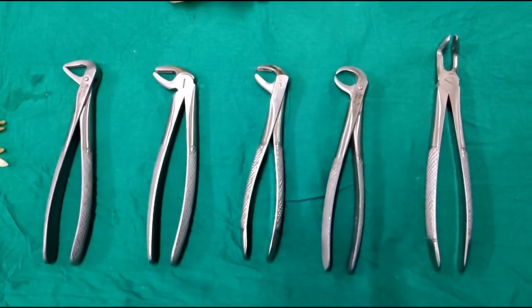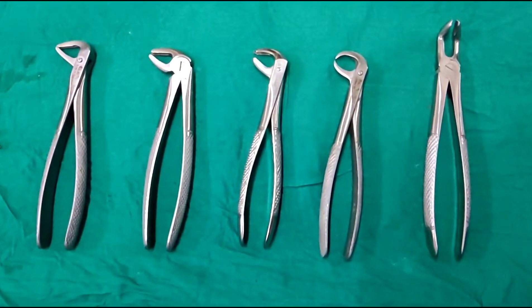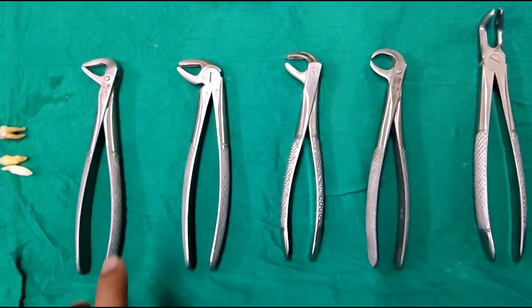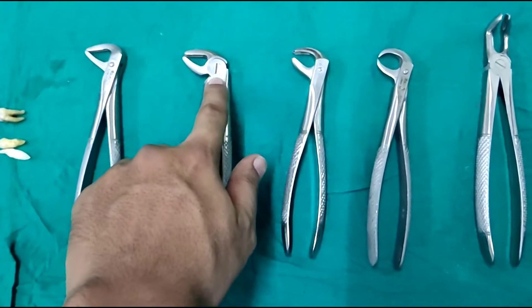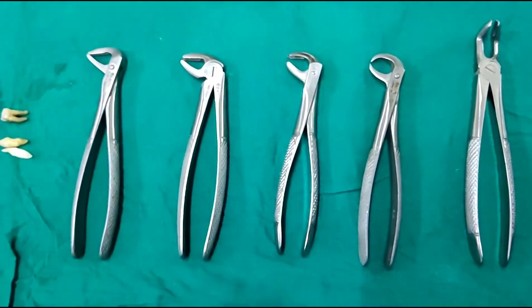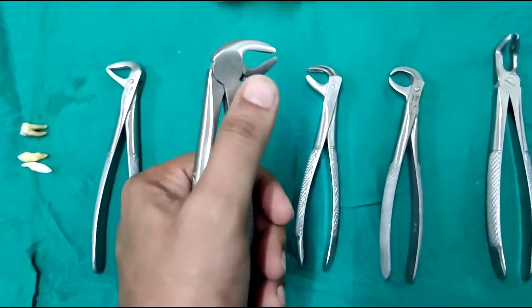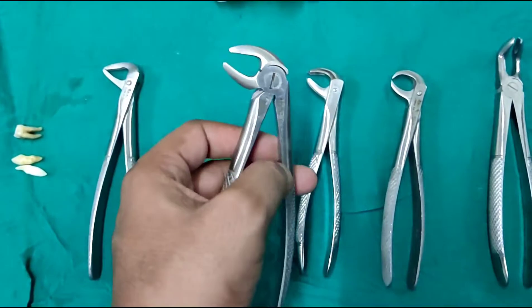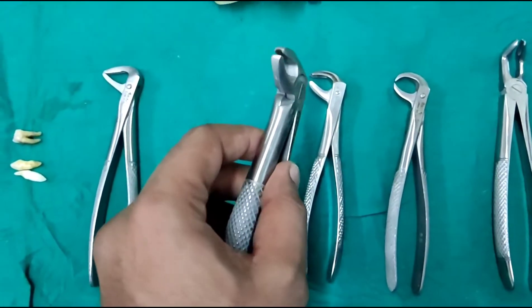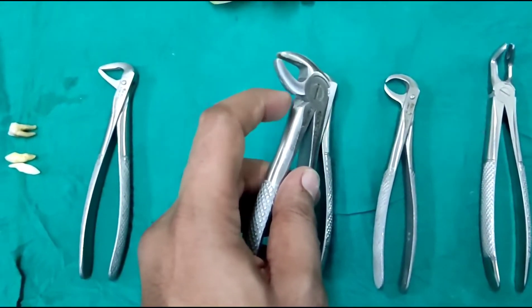Let us look at the dental forceps of the mandibular region, or the lower jaw. Each forceps, be it maxillary or mandibular, comes with three parts: the handle, the hinge, and the beak. The beak is the working part. The handle is used to hold the instrument, give us a grip, and transfer the force from your hand to the tooth. The hinge facilitates the movement of the beak and handle to transfer the force. The beak is the main part which engages with the tooth and helps in extraction.